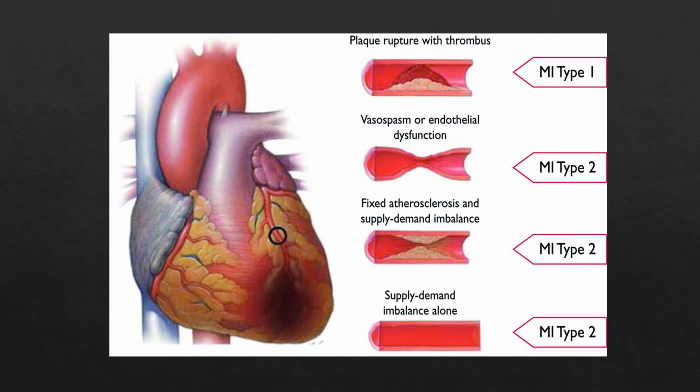And there can be other issues like supply-demand imbalance. You can have patients who just have poor perfusion. A good example is post-cardiac arrest patients. The AHA now doesn't recommend doing an ECG for the first, I believe it's 8 minutes post-cardiac arrest because it's non-diagnostic, because the heart was in a terrible supply-demand mismatch. You can see ST elevation even in profound shock and extreme hemorrhage, multiple different instances.